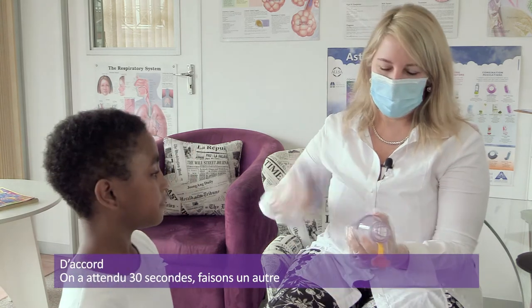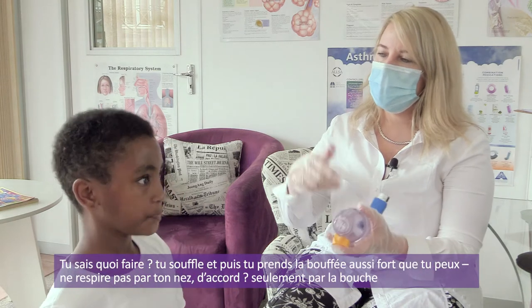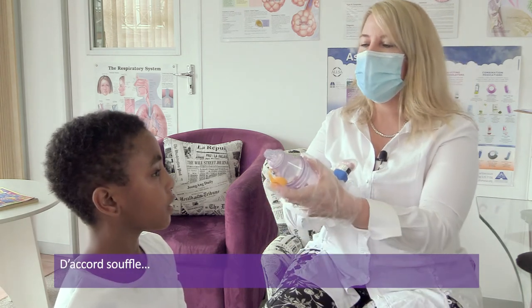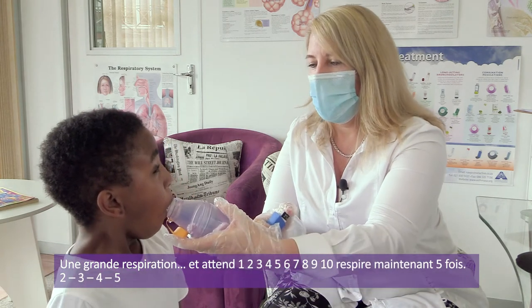All right. Okay. So we've waited 30 seconds. Let's do another one. So you know what to do. Breathe out and then you suck it in as hard as you can. Don't breathe in through your nose. Suck it in through your mouth. Okay, breathe out. Okay, now a nice deep breath in. Okay, hold.